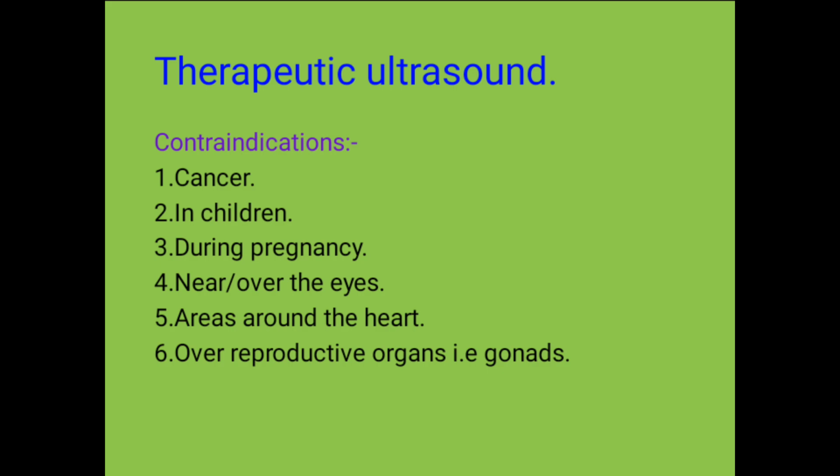Again, it should not be used around the heart. The reason is that it will interfere with the electrical signaling of the heart, and this will lead to conditions such as arrhythmias. Yeah. And again, therapeutic ultrasound should not be used over reproductive organs.